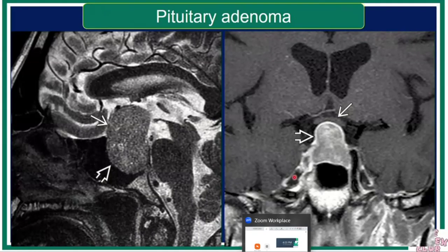You brought up the other tracer, methionine, that is useful. The other PET MRI technique that some people talk about is a combination of FDG with dotatate because they have different uptake. FDG is usually taken up by adenomas, whereas the dotatate is taken up by the normal pituitary tissue. That differential tracer uptake by the adenoma and the gland itself has higher sensitivity than thin slice MRI or using dotatate alone. So there is research going on into differential enhancement, or the use of two tracers instead of one, to localize smaller adenomas.